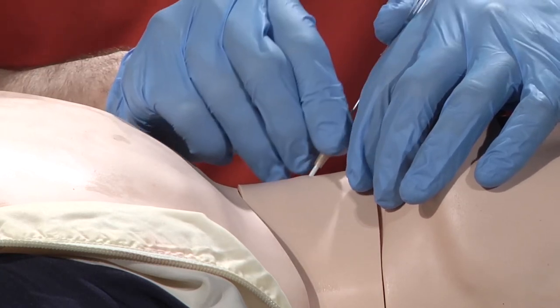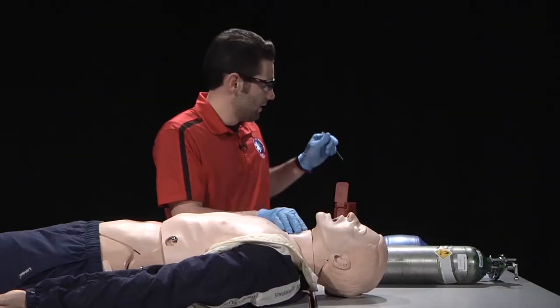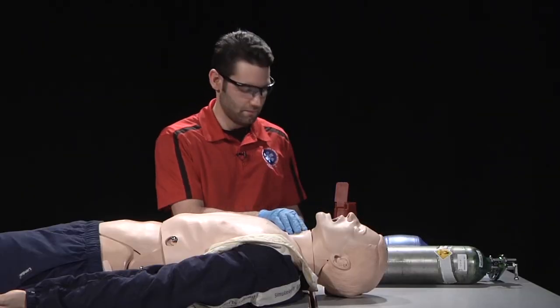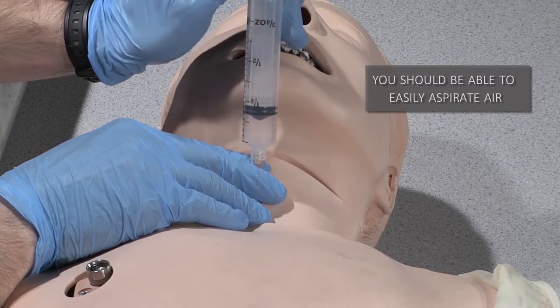Stabilize the needle and advance the catheter. Remove the needle and dispose of in sharps container. Attach syringe and aspirate to confirm placement in the trachea.